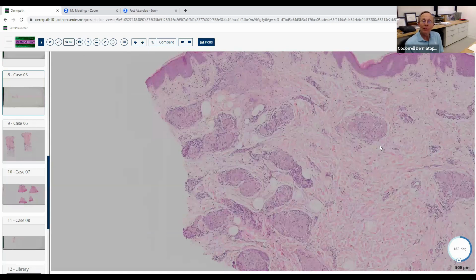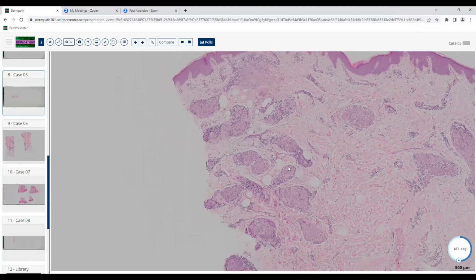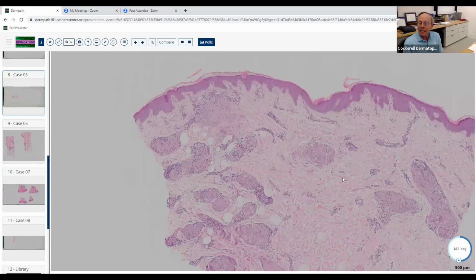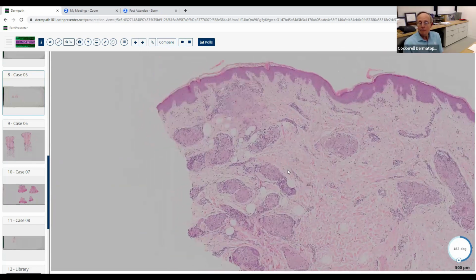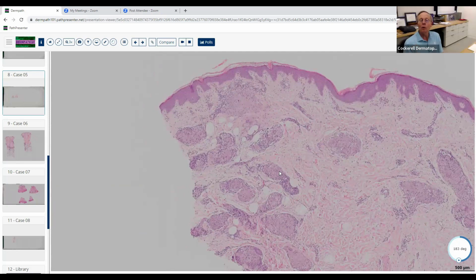They usually don't give you these nice tight granulomas like you see here, these sarcoidal granulomas, but they do give you a sarcoidal granulomatous pattern. So that's good. The last one maybe: what if this came from the face? Granulomatous rosacea. Good, superb, excellent. That can give you a sarcoidal granulomatous inflammation as well.